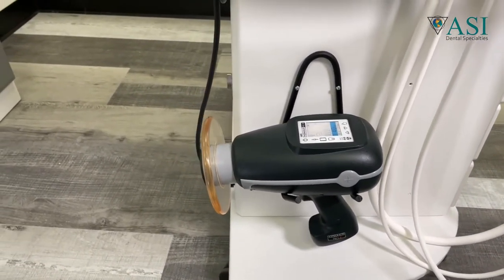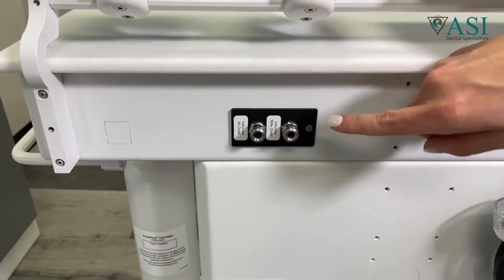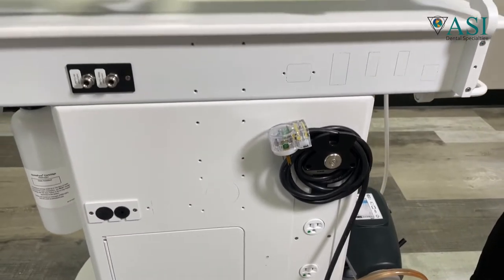The back of the unit has air-water quick connections and a convenient electrical outlet if you want to use tabletop ultrasonics, an air micro-etcher, or other items.